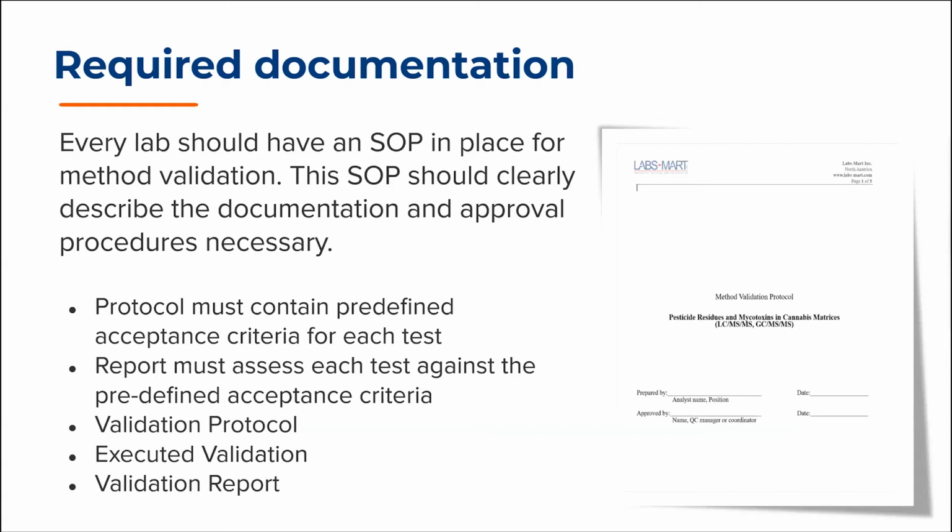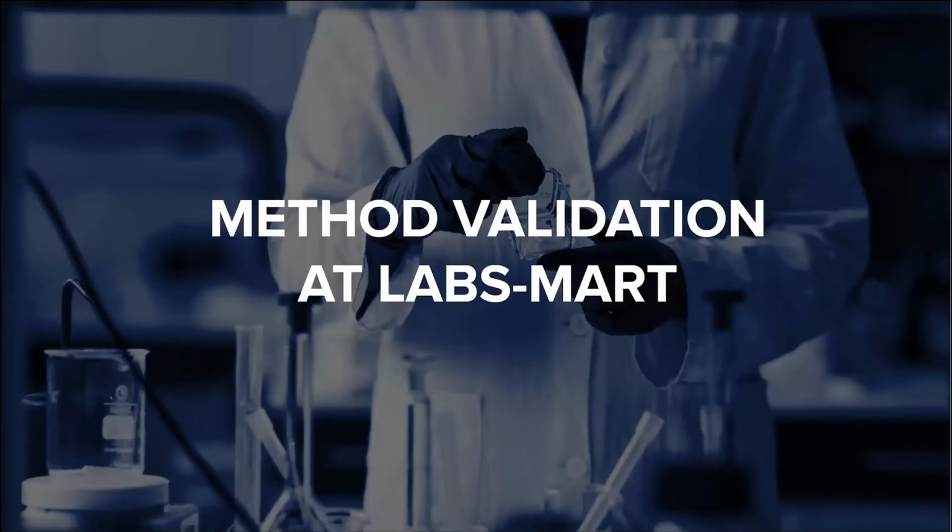Validation reports should be comprehensive and as close to standalone as possible. By standalone, I mean it has all of the data necessary to correlate that which is discussed in the previous 4 sections. I have personally written validation reports that are over 1,000 pages and describe the outcome of over 100,000 individual results. These are typically massive documents and provide a thorough description of the method's capabilities and limitations. So now with the documentation in order, it's time to actually head into the lab.